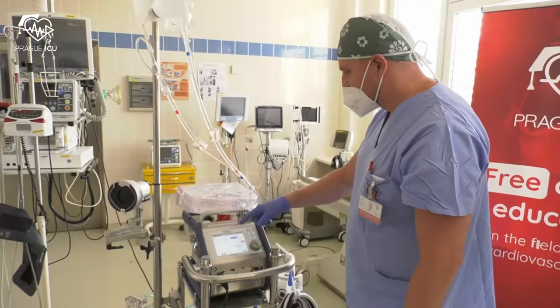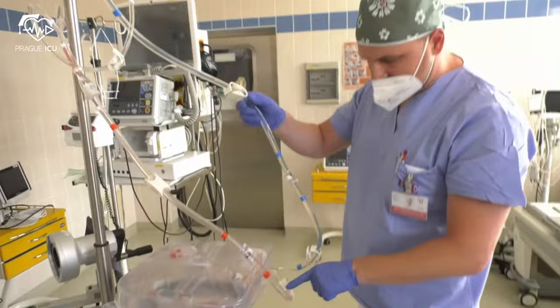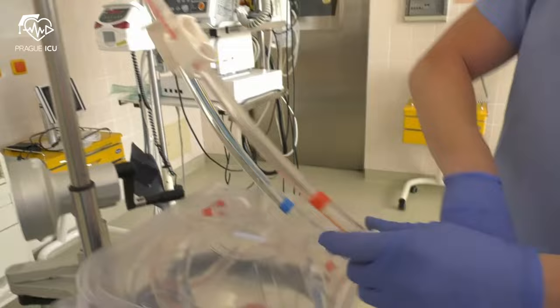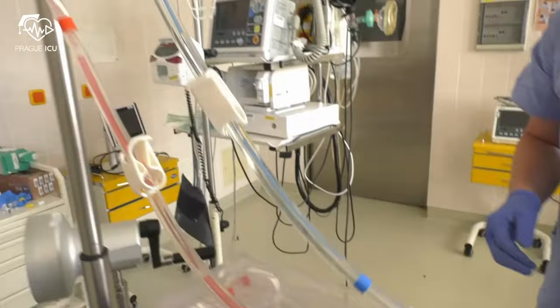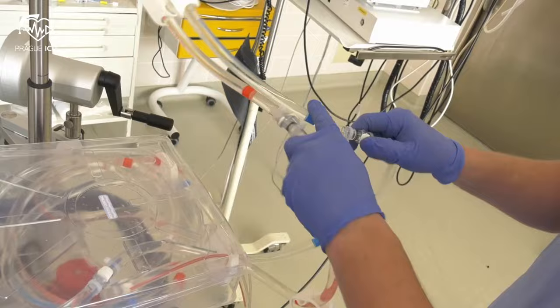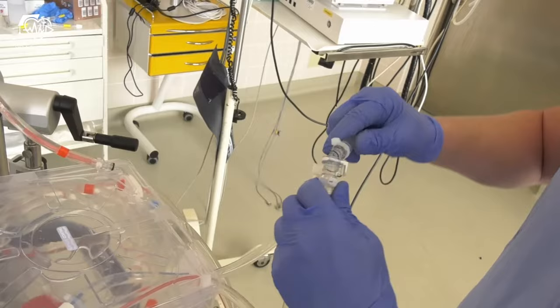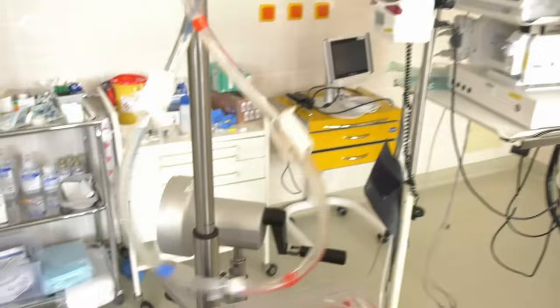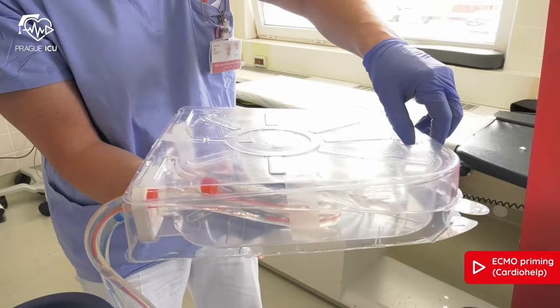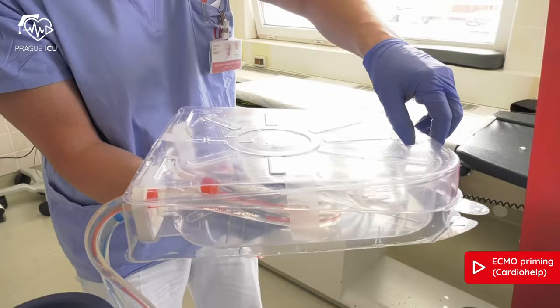Deactivate the Global Override. Close all clamps on the blue and red lines. Separate the priming set from the table set. Now you are ready for safe sterile transfer of the lines.